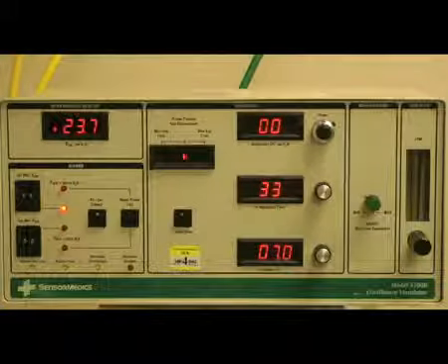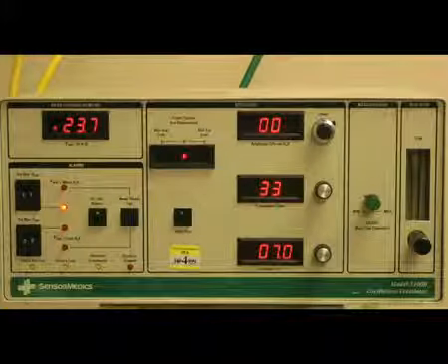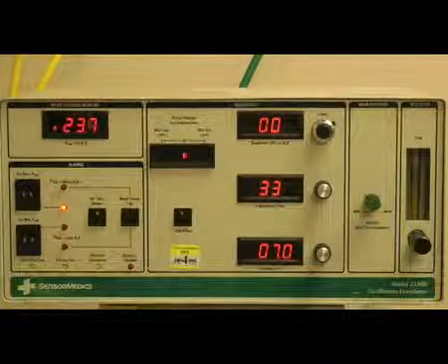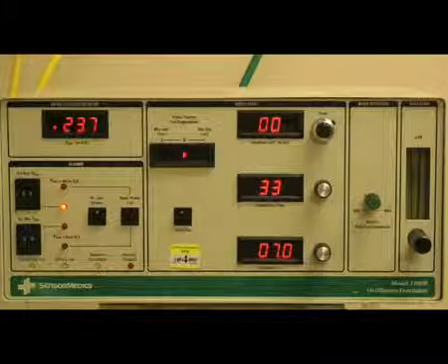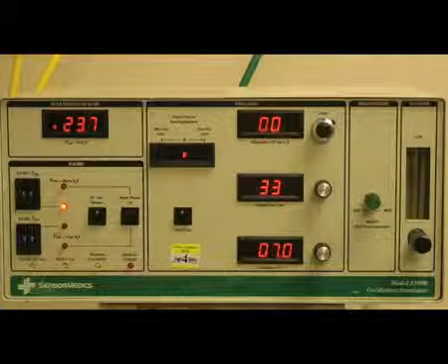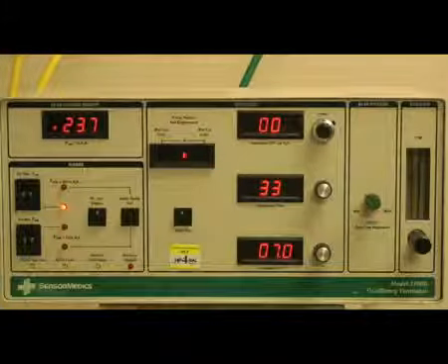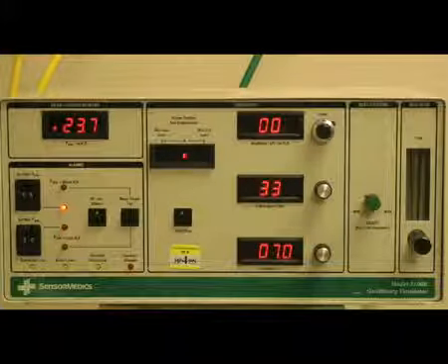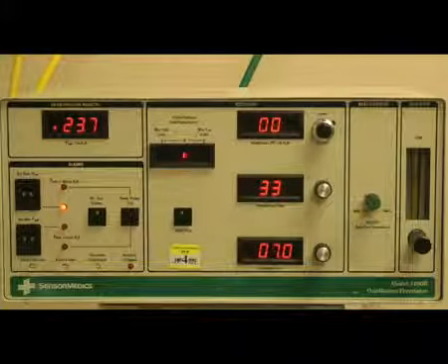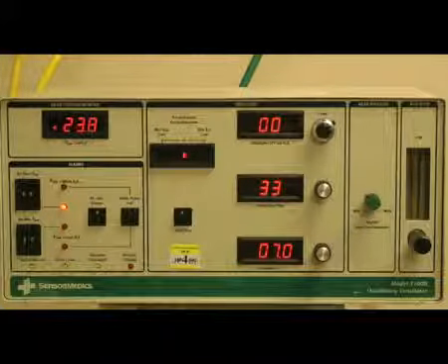If after 4 hours your oxygenation is greater than your goal range, you can decrease your FiO2 or your mean airway pressure every 2 hours. Typically, this is done by decreasing your FiO2 by 5 to 10%, or by decreasing your mean airway pressure by 2 centimeters of water pressure. However, if your oxygenation is less than your goal range, you can increase your FiO2 or your mean airway pressure every 5 minutes, again increasing your FiO2 by 5 to 10%, or increasing your mean airway pressure by 2 centimeters of water pressure.